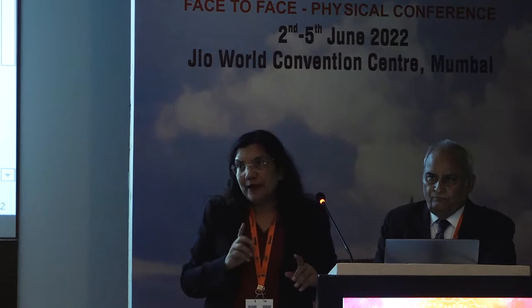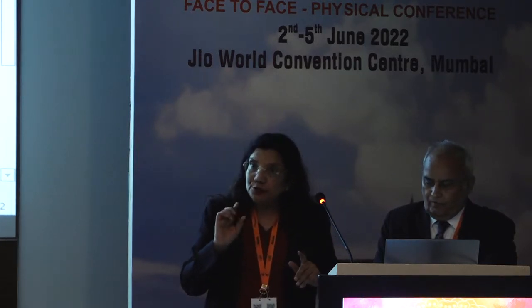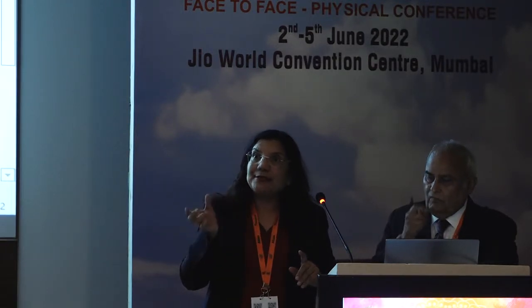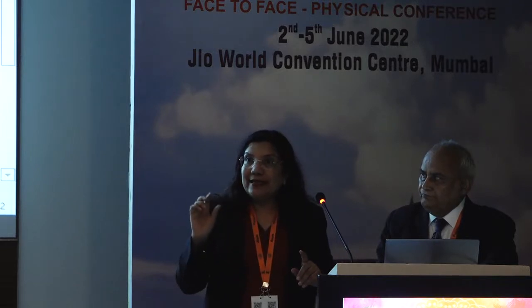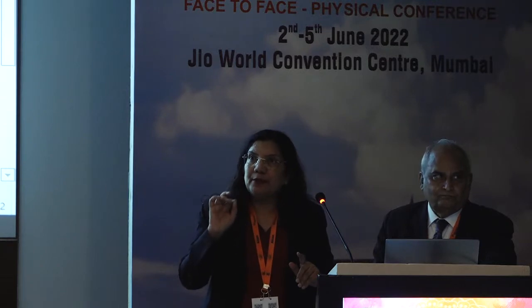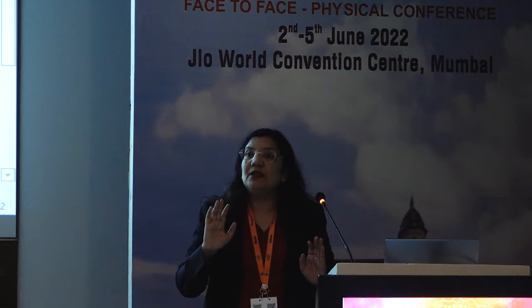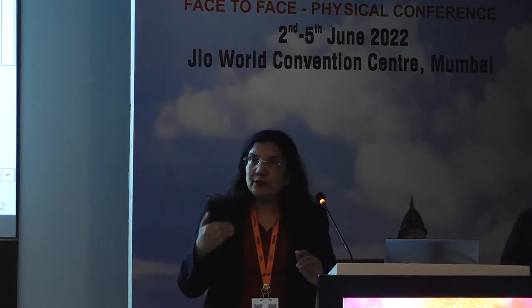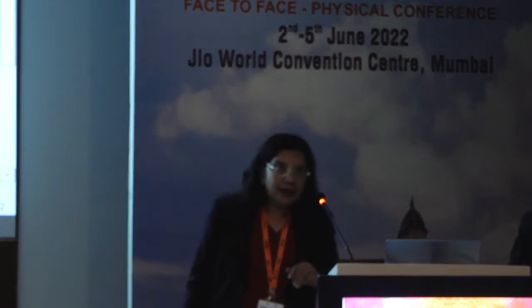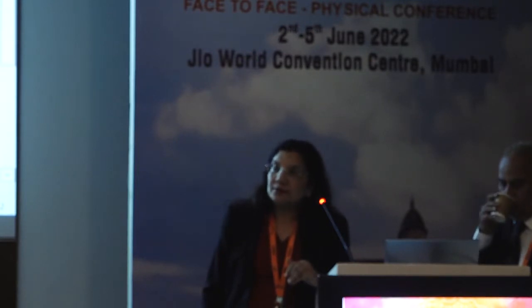And in case you find that your incision is big, we always advocate that we say it is suture-less surgery, but let us make it a less-suture surgery, because we are taking fewer sutures. But in case where you have a doubt, where there is a buttonhole, where there is a premature entry, it is always safe. It is better to put one suture rather than have problems with a wound or with infection. So in case you are using a larger incision, then it is better to put in a suture.